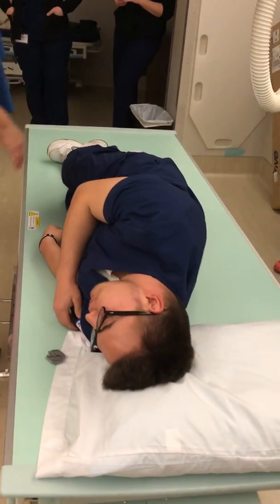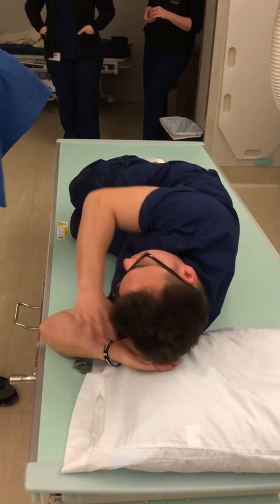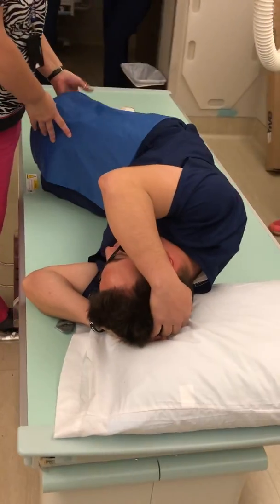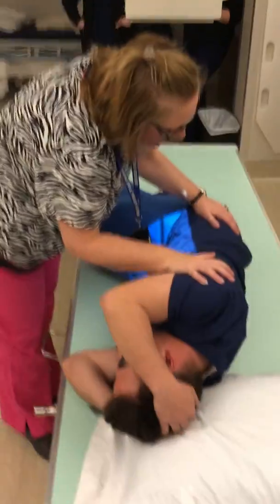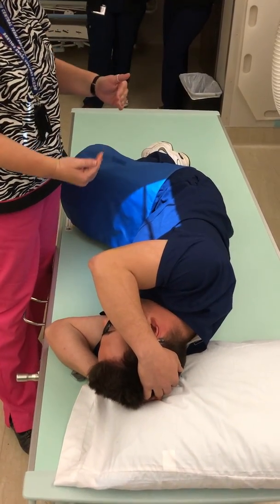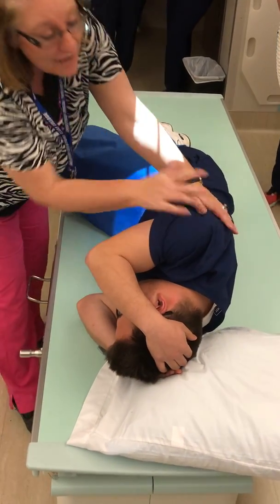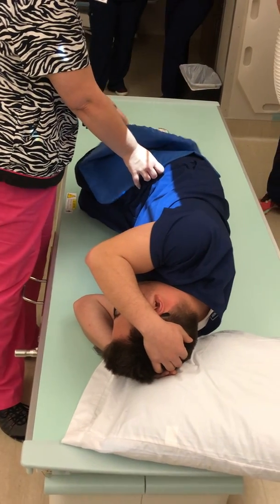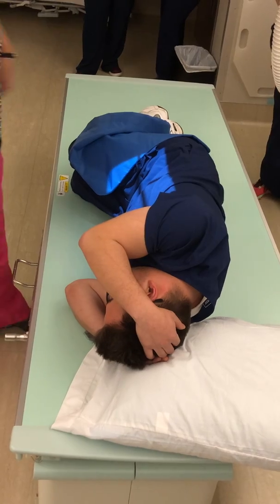There you go. Go ahead and bend your knees and hips, and bring your arms up kind of like a prayer position or a good sleeping position there. Okay? True lateral. So this means that I either need to bring his shoulders back or his hips forward. So I'm going to move your shoulders just a little bit. I physically move the patient because it's easier and I know exactly where I want them to go. On a slippery table, it's not that hard to accomplish.